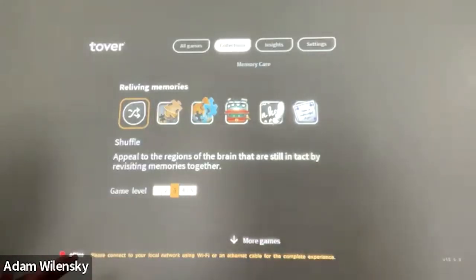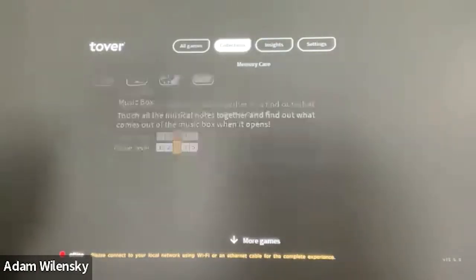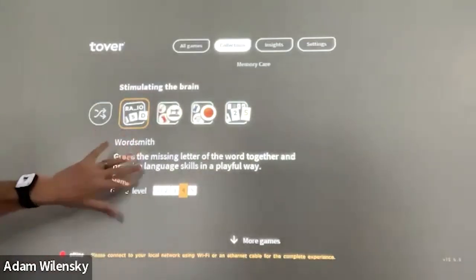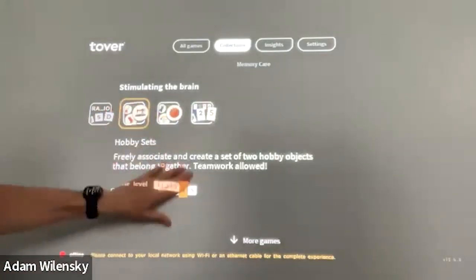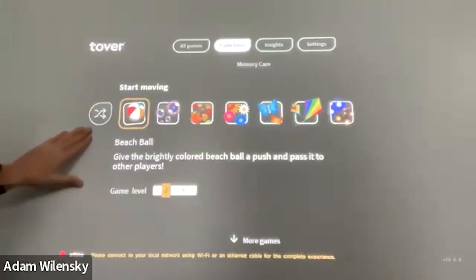One of the things that I have found repeatedly is that challenging games work really well with high acuity residents. They seem to be especially motivated to give it a try. And what I found as well, which I just love, is that their other residents will support their efforts. And so what you'll see is that they start to collaborate with each other. They start to fill in the gaps. They support each other during the general process.